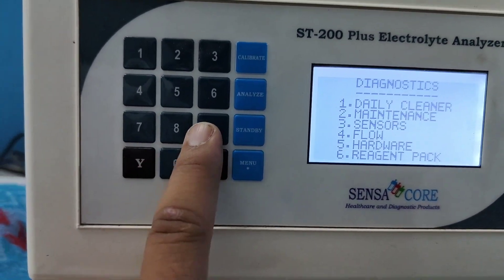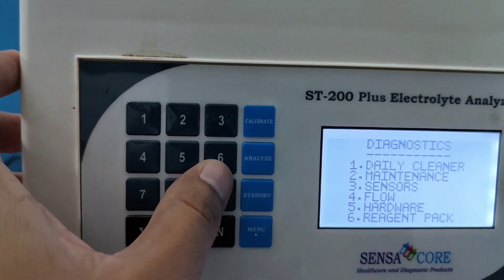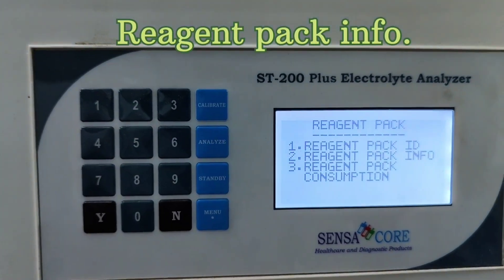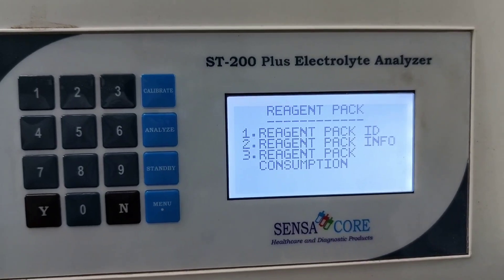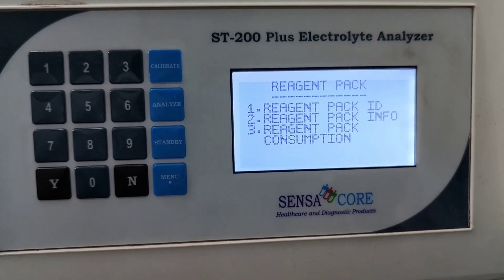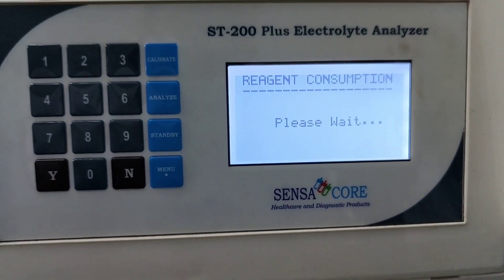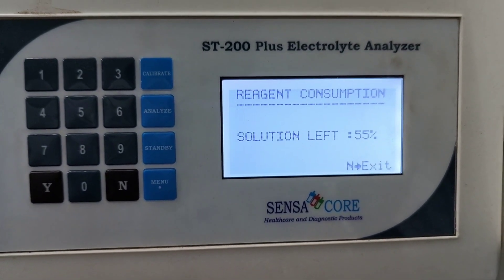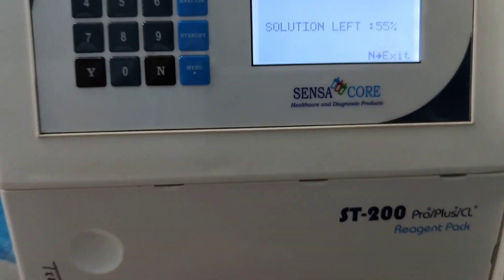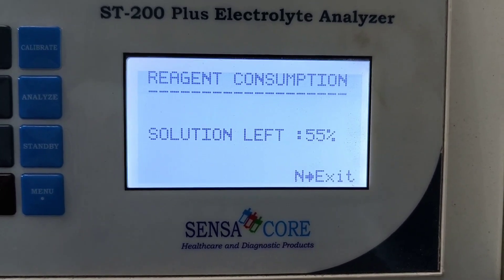By pressing six, I am going to show you the reagent pack info. Reagent pack ID, reagent pack info. Number three — reagent pack consumption. It's showing that this is the reagent pack and solution left is 55 percent.